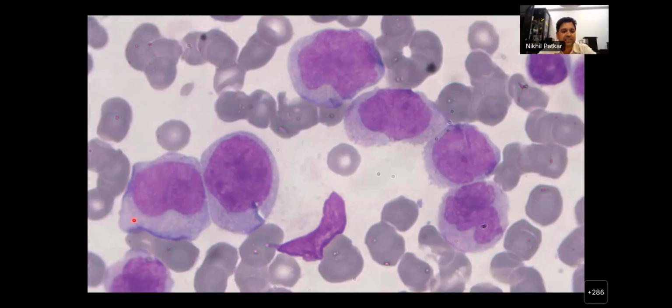Okay. Now what is this fellow? What do you think the shape is? Does it remind you of any reniform promonocyte? Yeah. So this is kidney, no? It is a kidney-shaped nucleus. So this is a reniform nucleus, and again same story, blue-gray cytoplasm and so on. So this is a promonocyte. All right. What do you think this is? This reminds you of which organ?